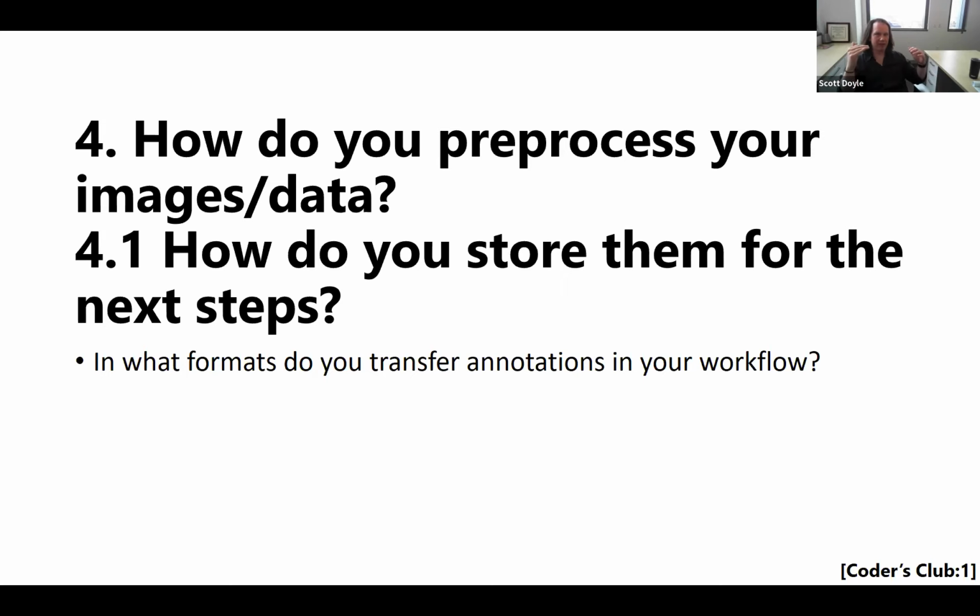There's an overhead associated with that computationally, but there's also overhead for the students to then figure out, okay, what is PyTables? What are HDF5 files? I've never heard of that before, right? And so you often, not just for data storage, but for every step of the pipeline, have to make those trade-offs between getting results quickly versus getting results most optimally.